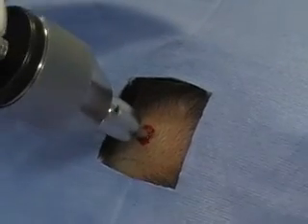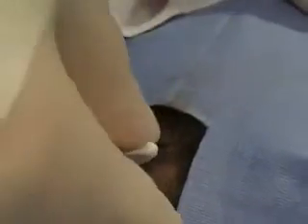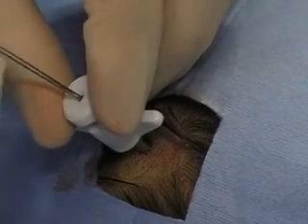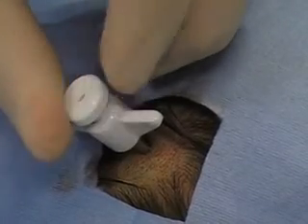You will usually be able to feel the drill bit penetrate the hard outer cortex, the soft central medulla, and the hard inner cortex. Place the bolt in position perpendicular to the skull and turn it clockwise, usually 9 half turns until it is secure. Loosen the cap of the bolt by turning the adapter counterclockwise and make a puncture in the dura using the dural puncture stellette. Cerebral spinal fluid may be visible at this point.